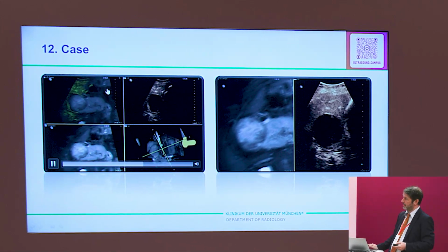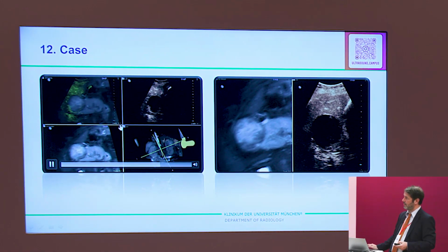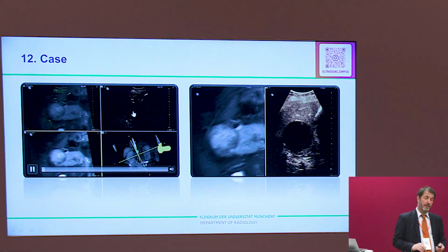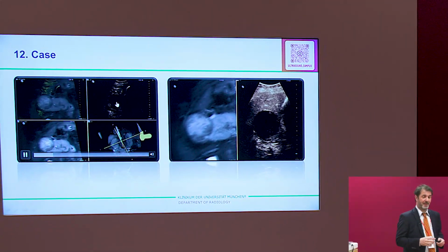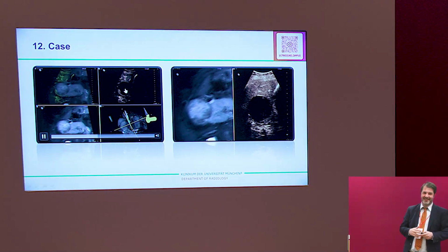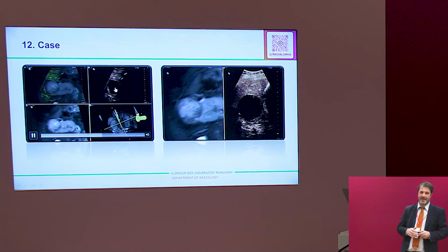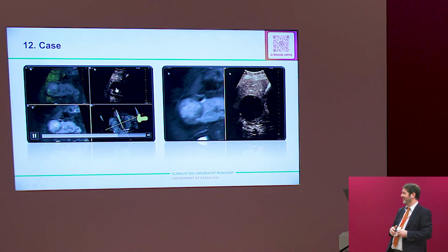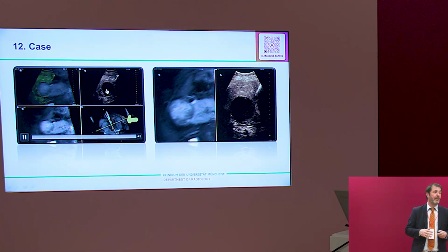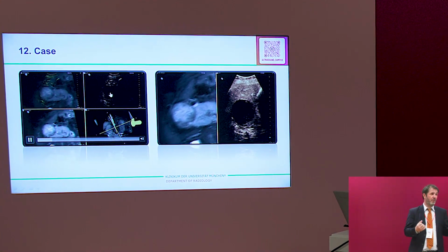There's our MRI lesion. There's our ultrasound lesion. What is it? What would be your best diagnosis? Alive or not alive? Alive. Not alive. It's black. Vincent, you have to help. You said alive. Alive, that means blood uptake or not blood uptake?